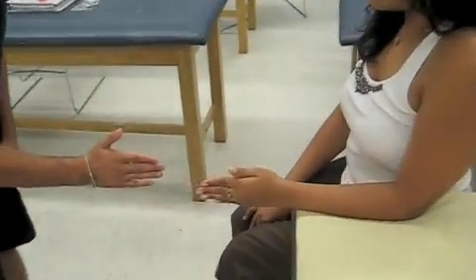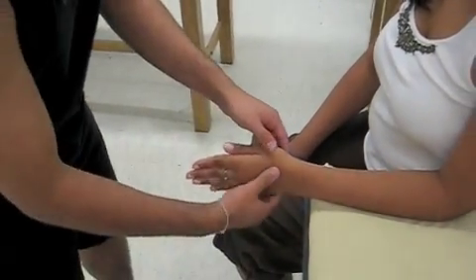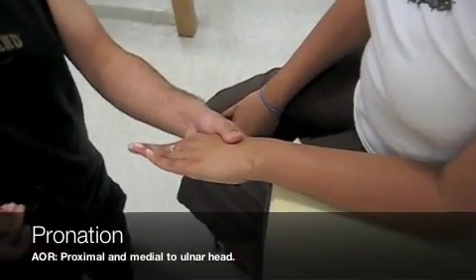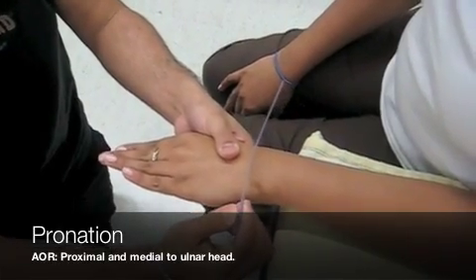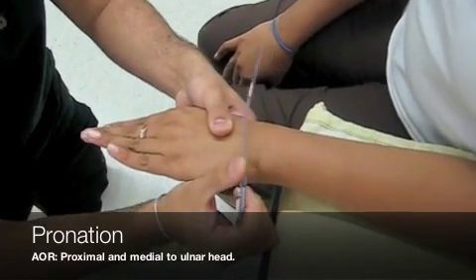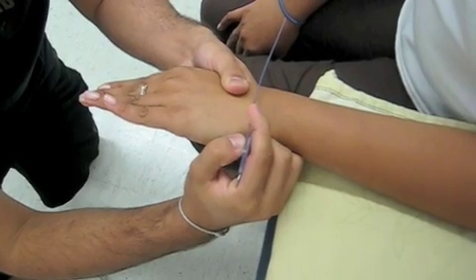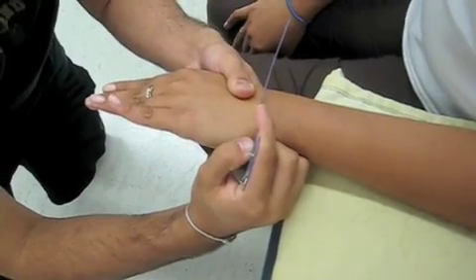I'm going to ask Deepo to move her hand this way, then bring it back. I'm going to move it for her and give it a little bit of overpressure. Now I'm going to take my goniometer. The stationary arm is going to be perpendicular to the floor, and the moving arm is going to be on the dorsal surface of the wrist. And I get 75 degrees of pronation.